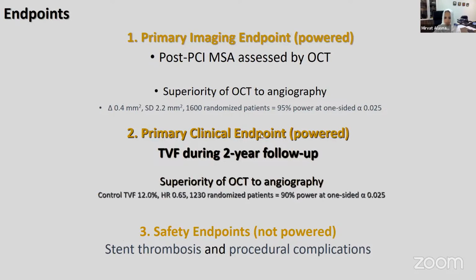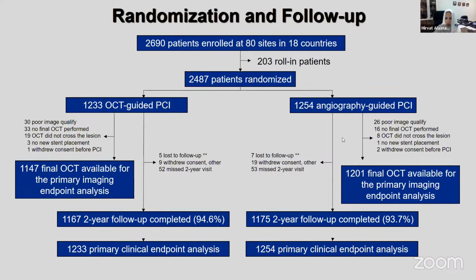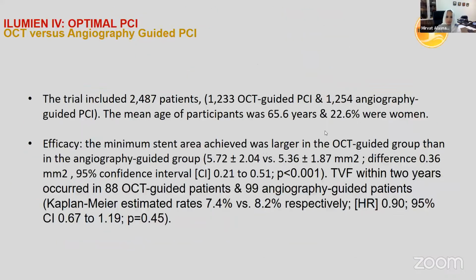There was an imaging endpoint and a clinical endpoint and a safety endpoint that was not necessarily powered, but the two primary endpoints were, and again, randomized to OCT versus angio only. And they ended up with over 2,400 patients.